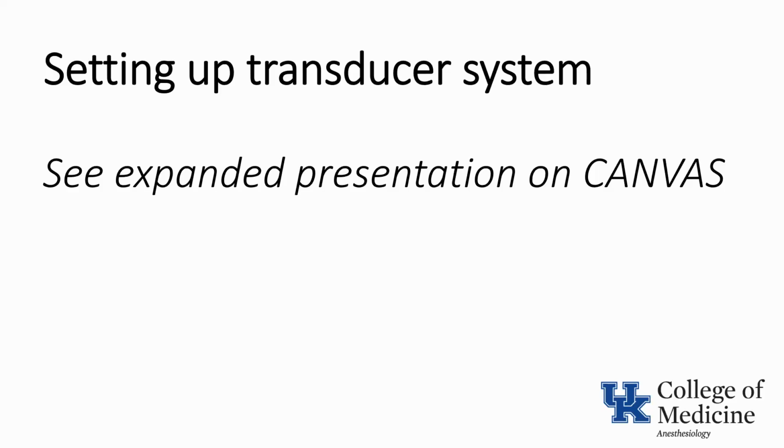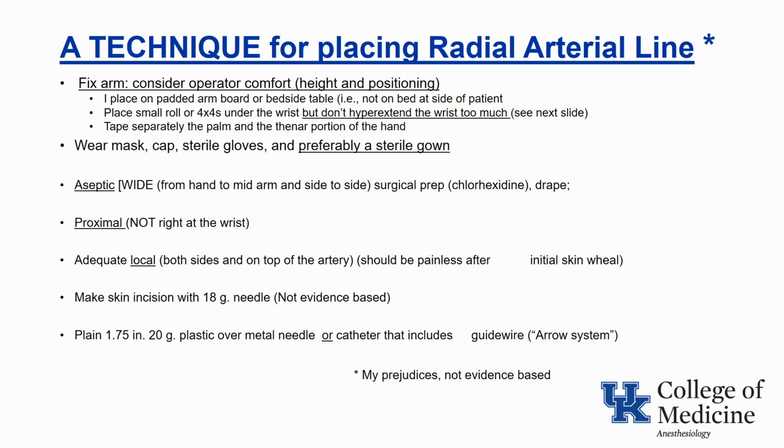In the Canvas expanded version, I've described how to set up a transducer system, which I think you should all be familiar with, and I recommend you review this section. On the next few slides, I've described my technique for placing radial artery lines, but it's just my prejudices and certainly not evidence-based. I will let you study this slide at your leisure.